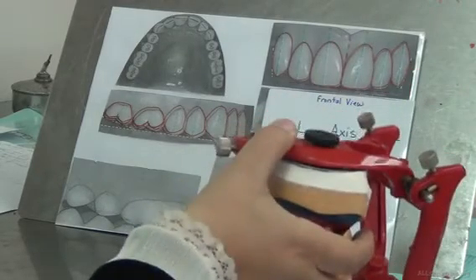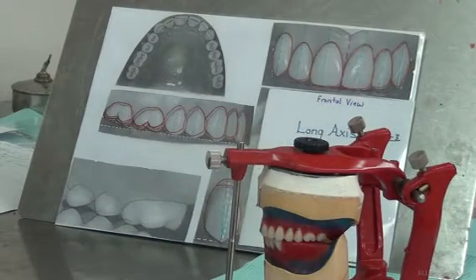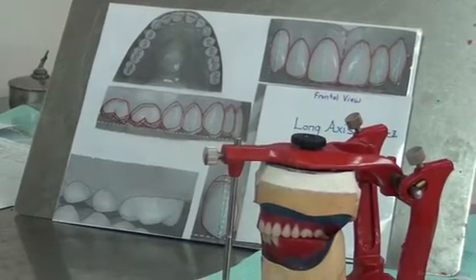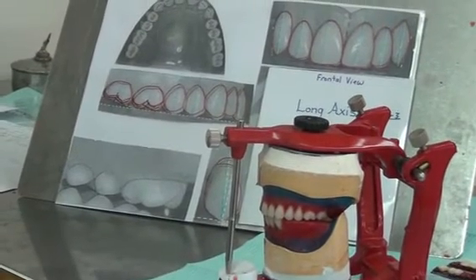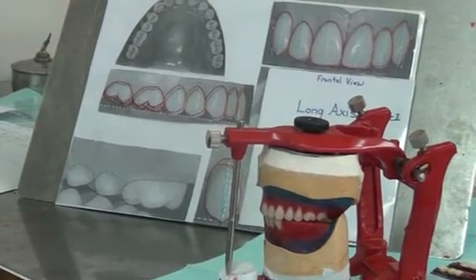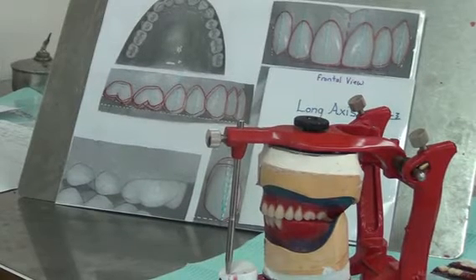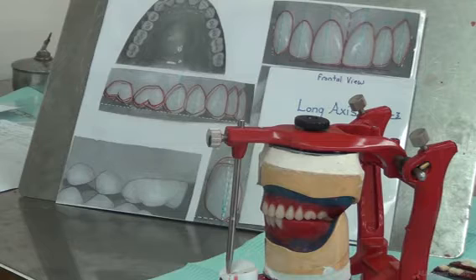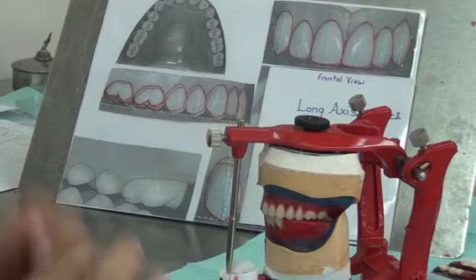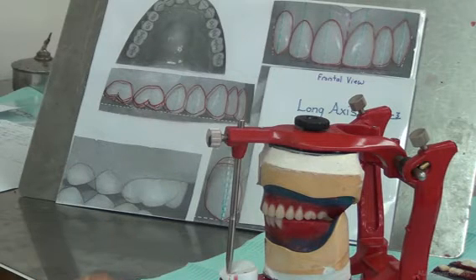We're going to talk now about how we're going to do the quality check for the upper setting, the setting of the upper teeth. First of all, when we do these quality checks, we do them at an early stage while we're doing the setting. We don't wait until we have the full arches set and then we begin adjusting tooth by tooth. It's preferred to begin this work at the beginning. Whenever you add a tooth, make sure that these rules apply. So what do we check when we are working?